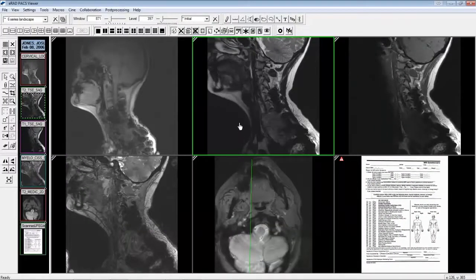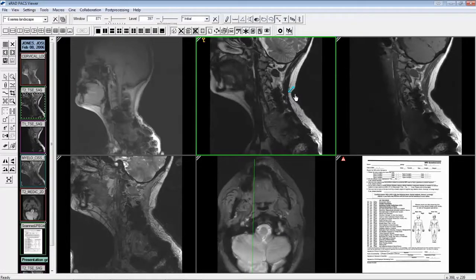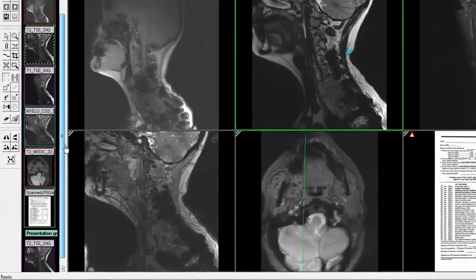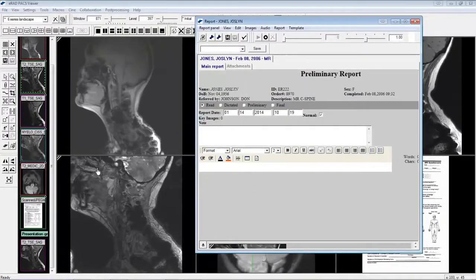Now, when I annotate an image with an arrow, I will automatically generate a key image. You can see the new key image in the thumbnail panel and in the full report panel.